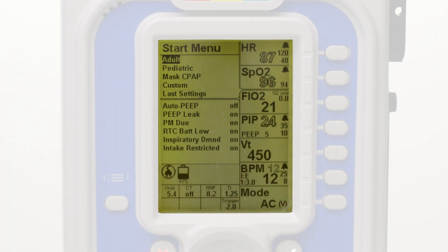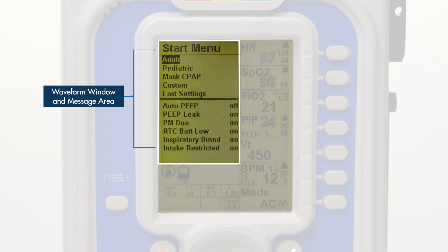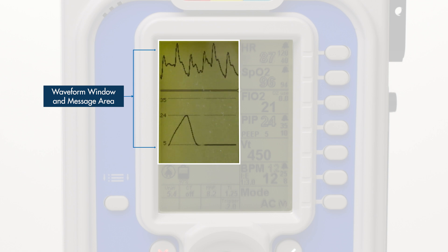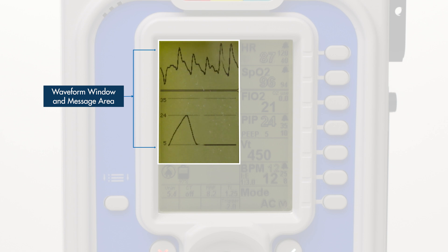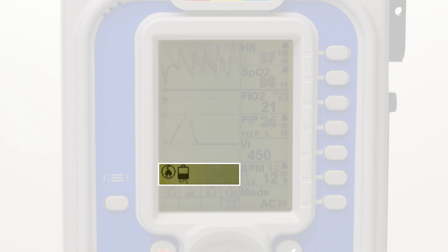The ventilator display is organized into four key functional areas. At the top left is the waveform window and message area. At first startup this area will show the start menu to load default patient settings. Under normal operation the waveform window displays plots for airway pressure, and if a pulse oximeter is connected, it also displays the pleth waveform. Directly below the waveform window is the icon tray, which displays key icons and notifications.